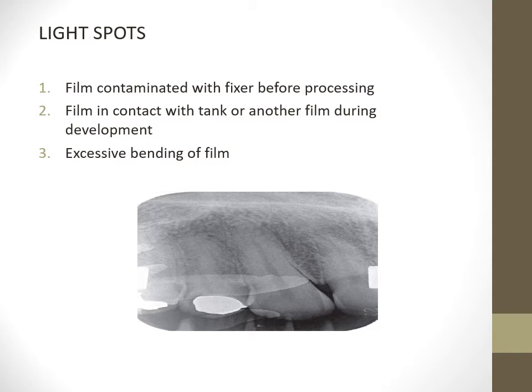Film in contact with tank or another film during development. If the film comes into contact with the tank or another film, this can cause this error. And excessive bending of film can cause light spots on the film. This is the light spots.